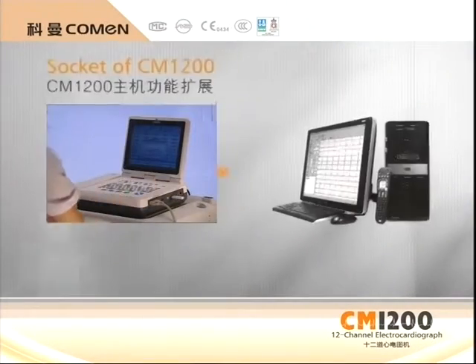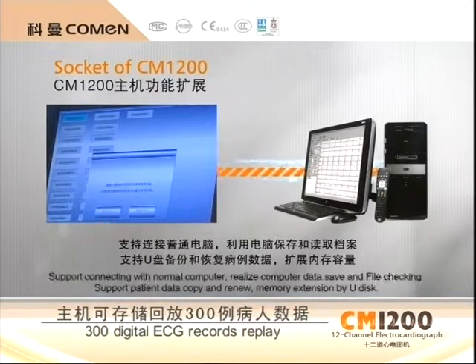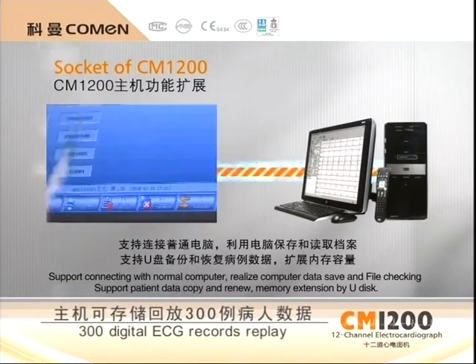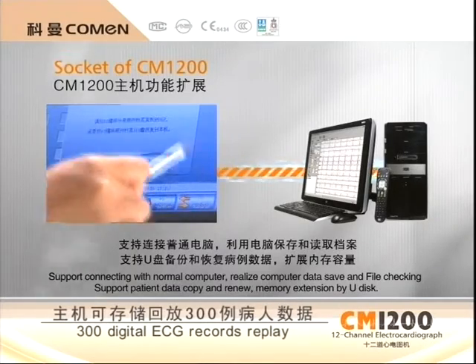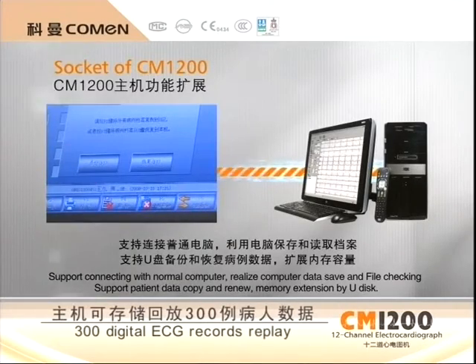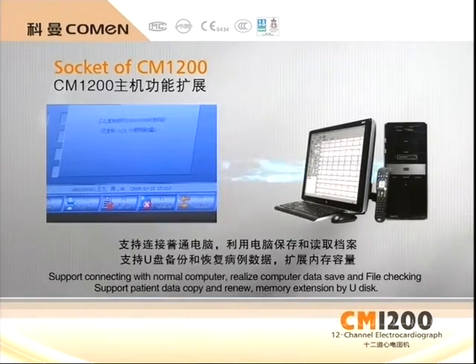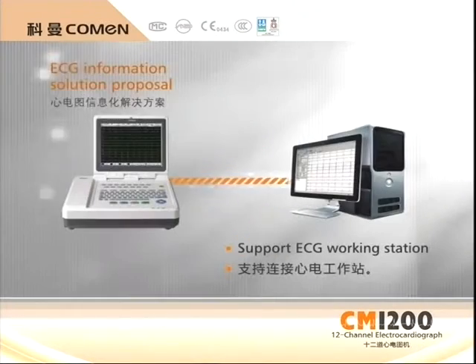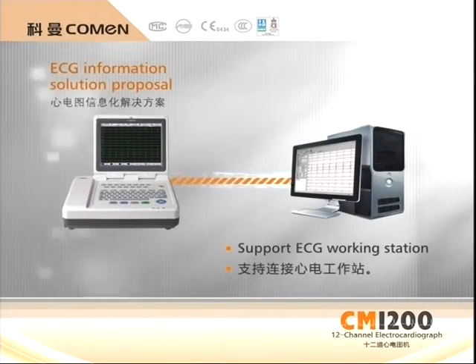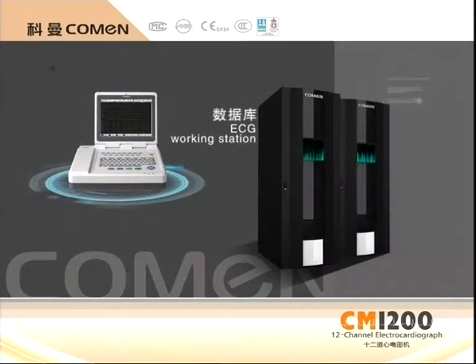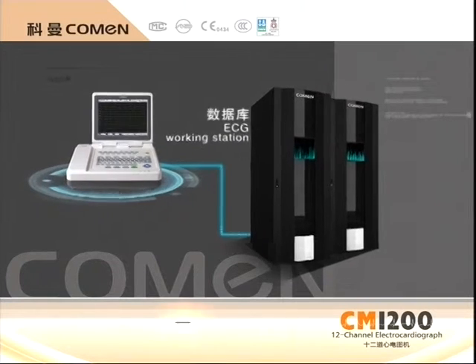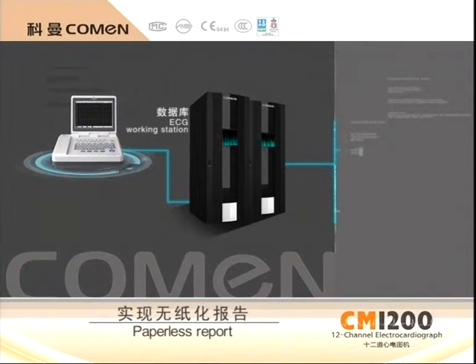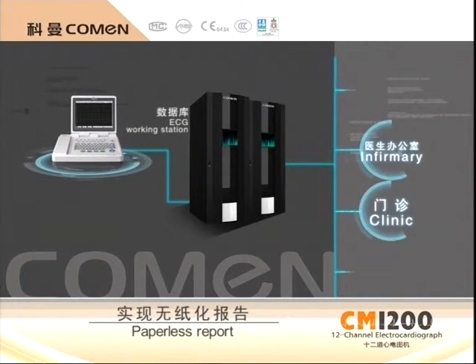It supports connection to general computers to save and read files, and also supports U-disc backup and case data recovery to extend memory capacity. Connection with an ECG workstation serves as an advanced information solution to realize paper-free reporting and remote diagnosis.